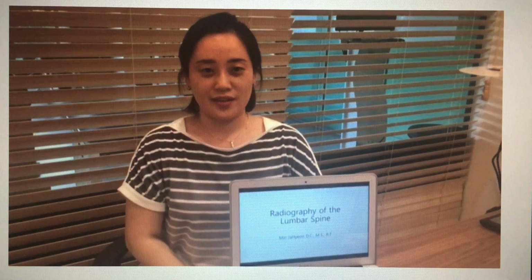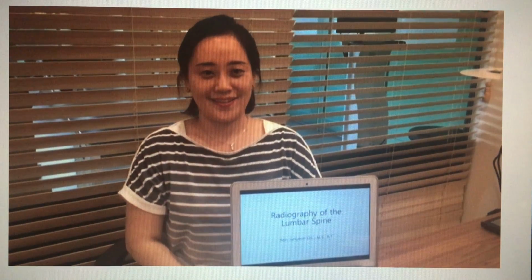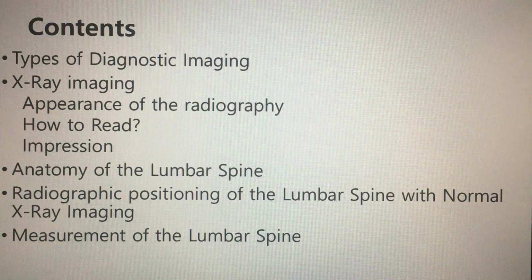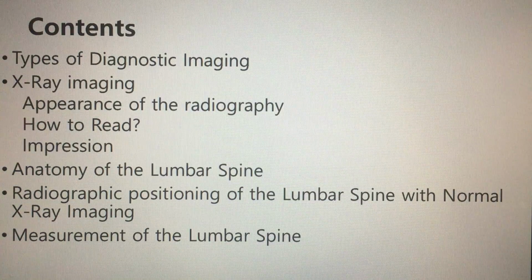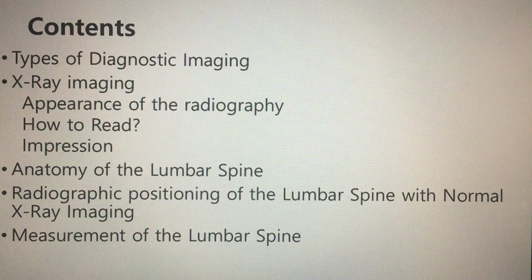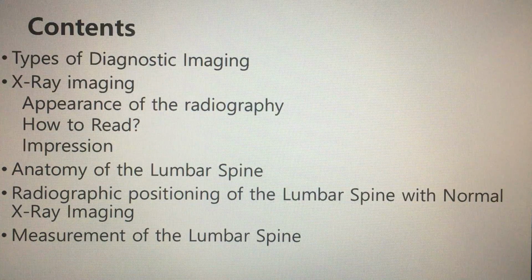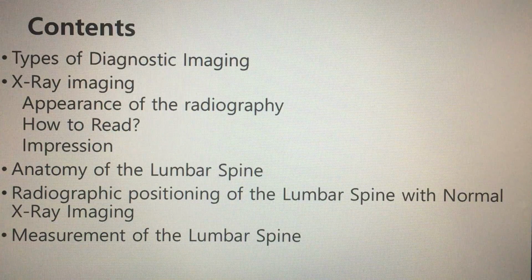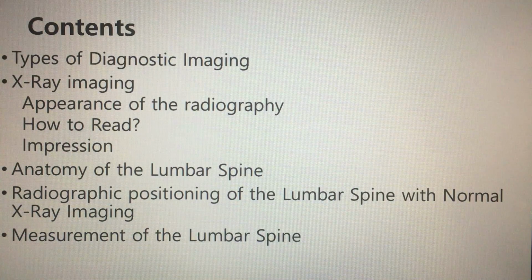Today I'm gonna do the radiograph of the lumbar spine. Let's take a brief look at what kinds of diagnostic images there are. Among them, let's look at how X-ray images are depicted, how they are assessed and read. Then check the anatomy of the lumbar spine. Let's see how to take an X-ray and what is the normal X-ray image of the lumbar region. Finally, let's take a look at some of the lumbar spine measurements.